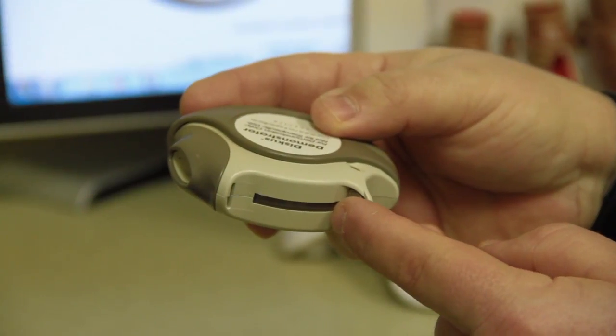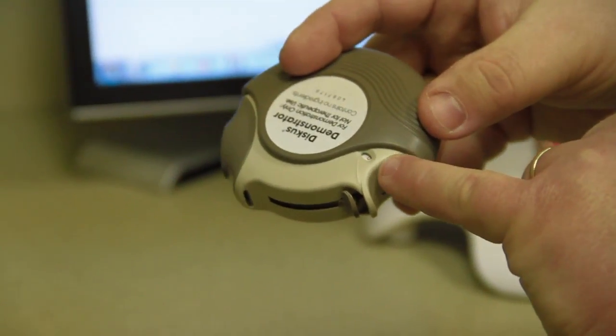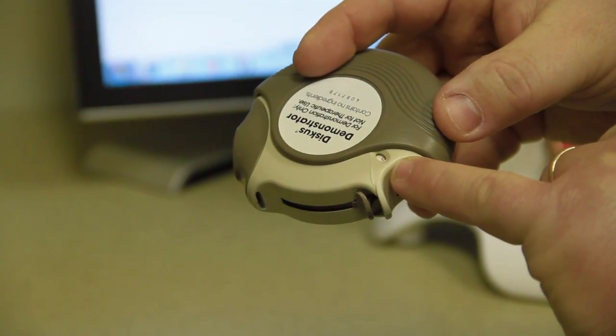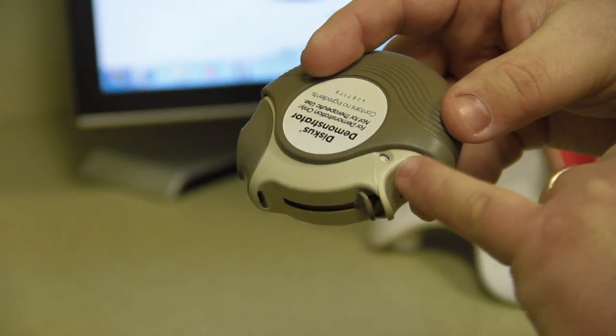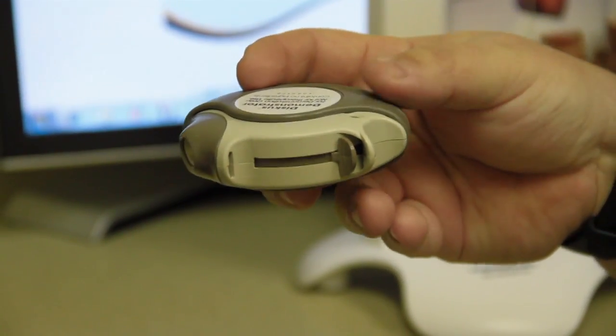I'm just going to push this back and demonstrate — and you hear a click — now the device is ready to use. When you prime the device to load a dose, there is a little counter here, and every time you use a dose, that number will go down by one, so that lets you know how many doses are left in the inhaler.